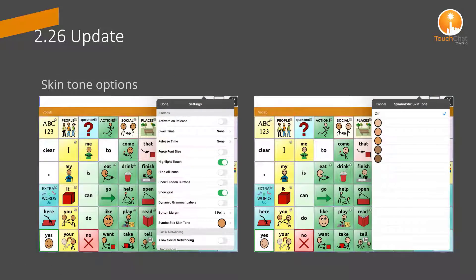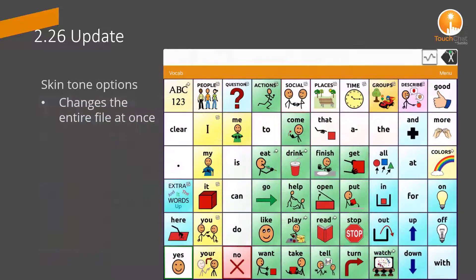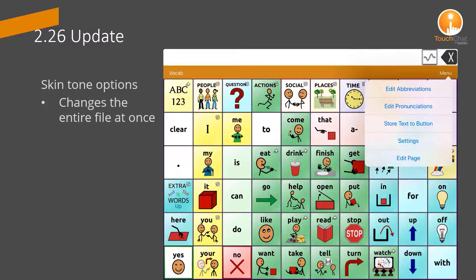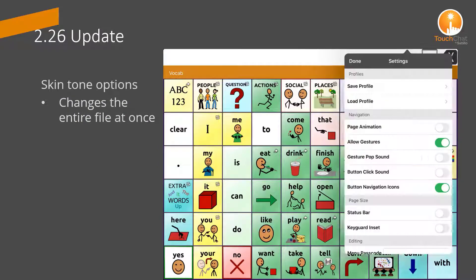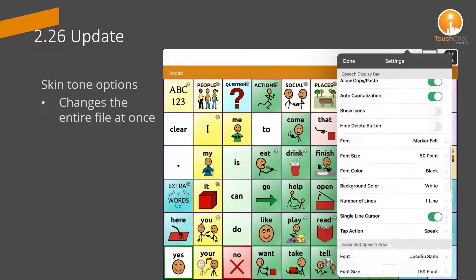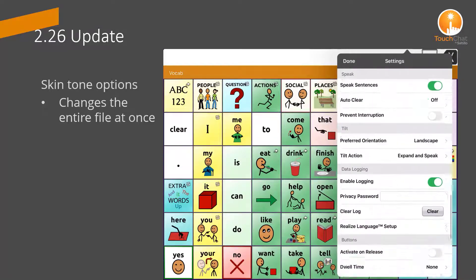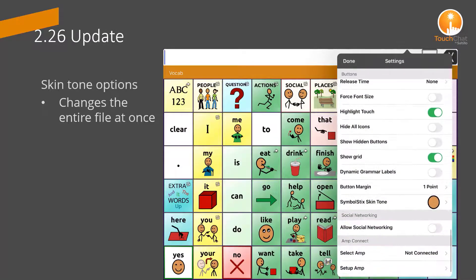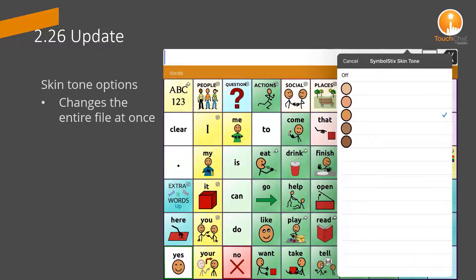The SymbolStix library has been updated to provide the option to change skin tones within a vocabulary. This new feature allows you to change the skin tone of all the images at once to better represent a person's uniqueness. The changes will be applied to the entire file through the settings.